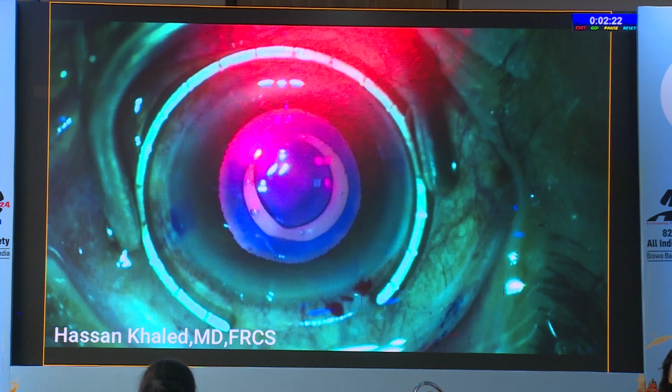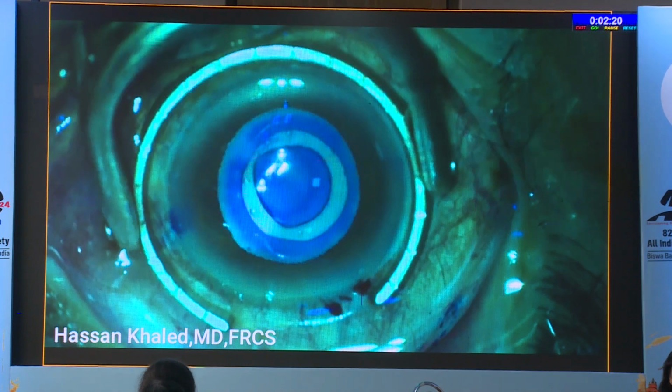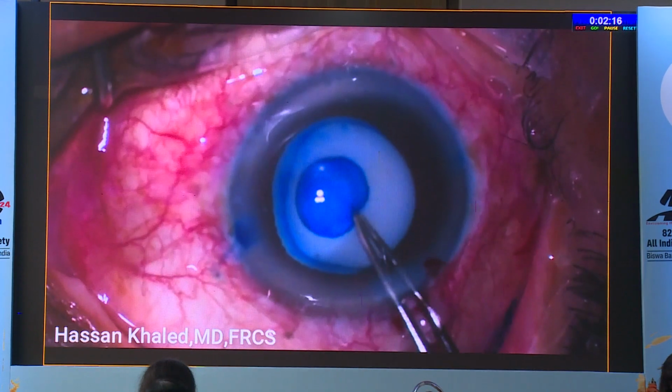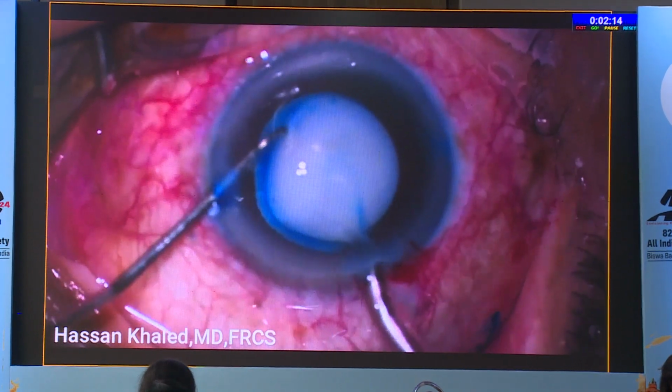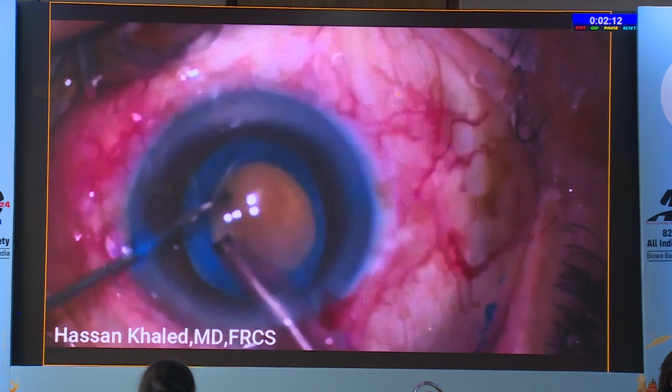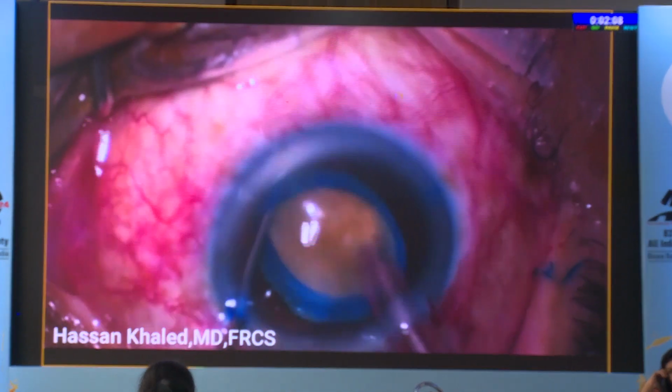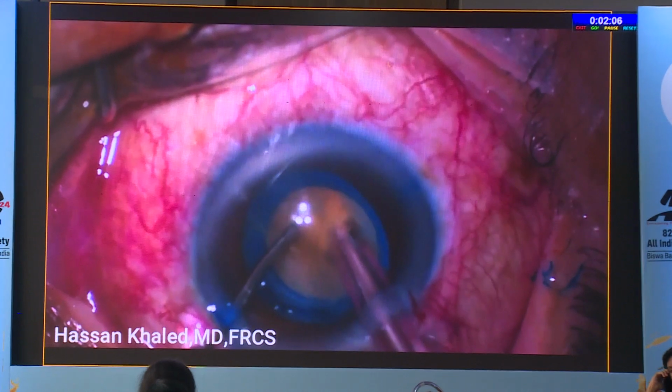And then we'll jump to the phaco after we slide the laser out. And what we'll see is the eye has a lot of milky fluid there, and as we come along, we can aspirate that away, showing that truly was the pressure that was built up there, and a very intumescent cataract. And as we know, the nucleus is not so hard once we've dealt with that pressure and the thin tissues.